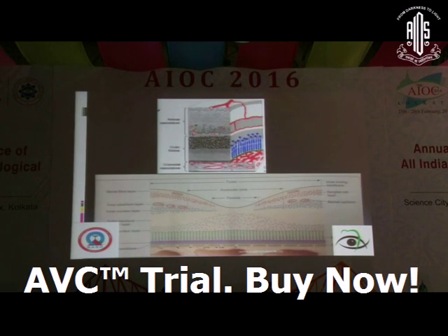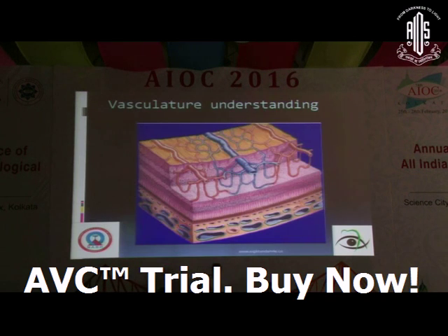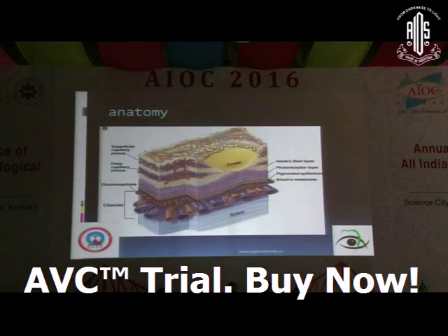To start with, we must understand the anatomy of the retina. The outer third is supplied by the choriocapillaris, with no retinal vasculature there, and the inner two thirds is supplied by the retinal vessels. This is how the vasculature is placed in the retina, and we can understand what is fluorescing and what is being blocked by the vessels.